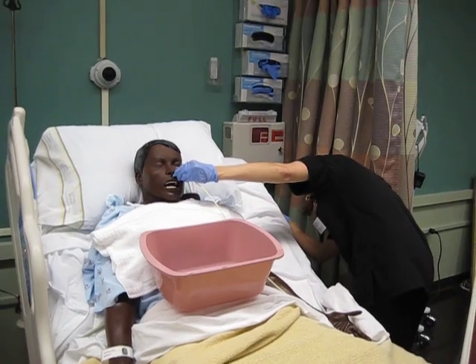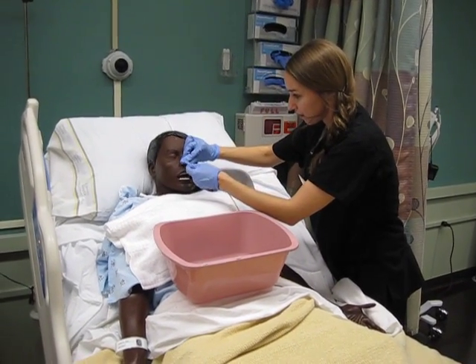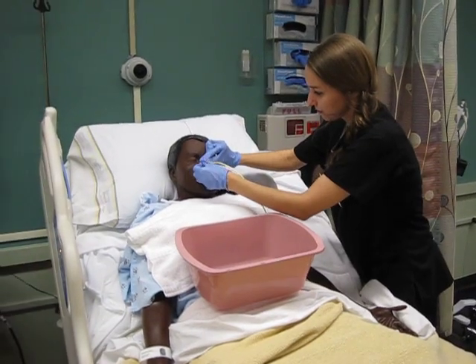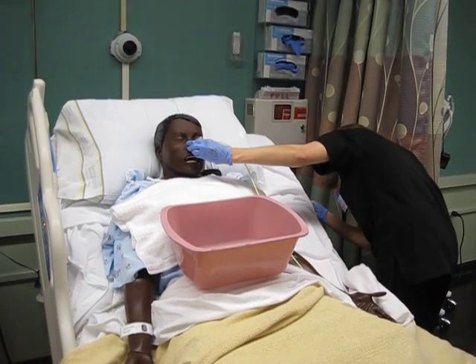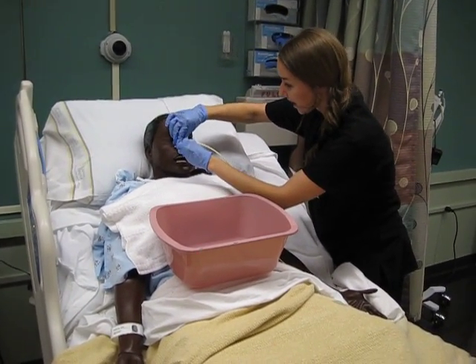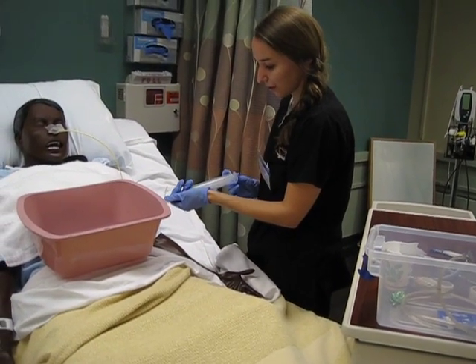Now I'm going to tape it real quick so that way the tube won't fall out of place. And we're just going to secure it with this piece of tape right here. Does everything feel okay? The next thing I'm going to do is aspirate a little bit of your gastric contents out just so that we can check and make sure it's in the right place.